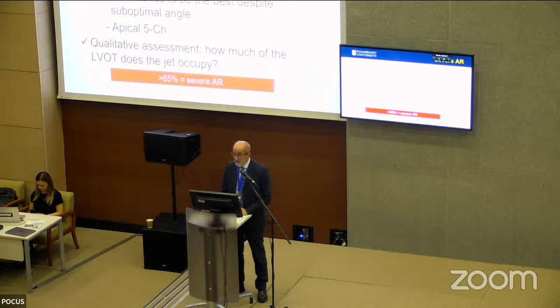If it is more than 65% of the LVOT, then this is a sign of severe aortic regurgitation.